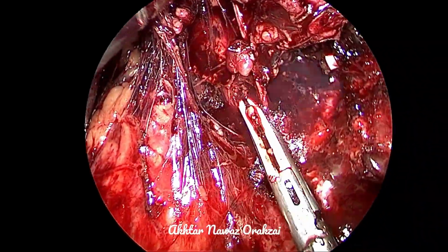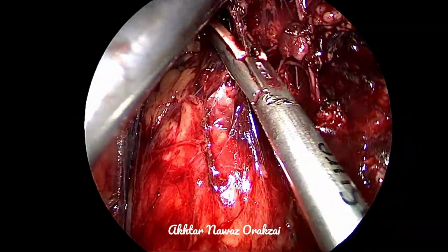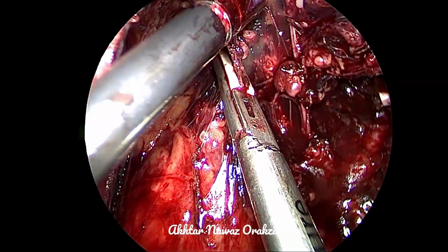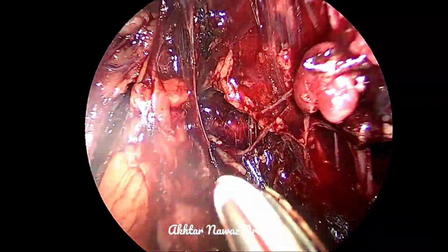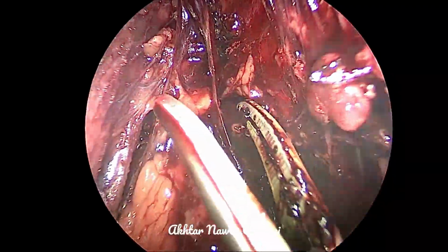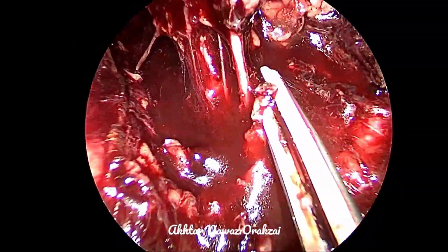We can apply a clip to all the bunch, however we want to dissect it more clearly so that it can be visualized clearly and injuries to any other vessels are avoided.